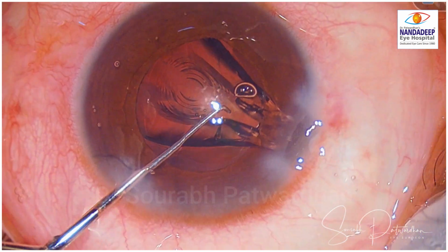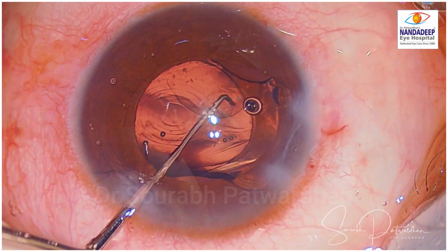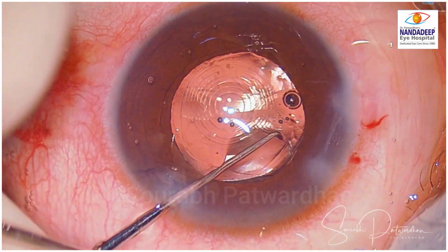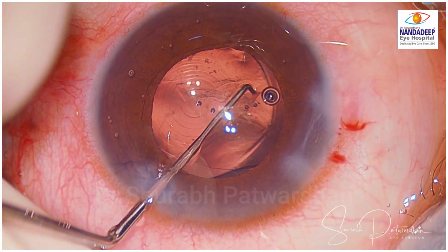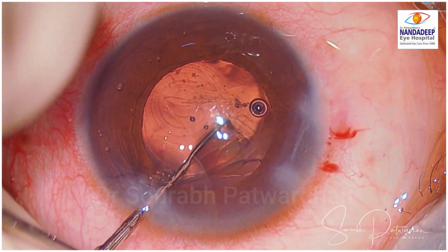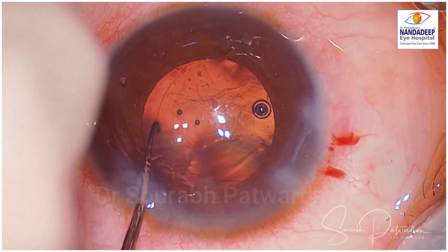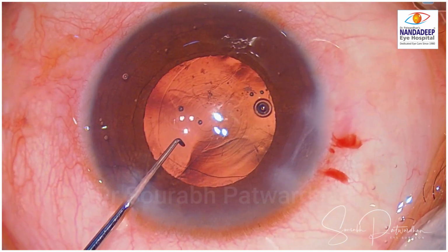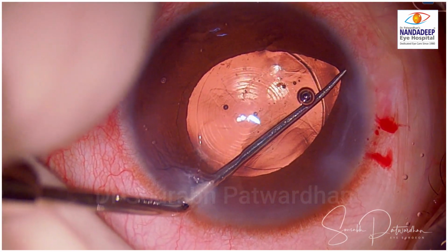So here is a case I am showing where I am implanting a plate haptic trifocal IOL in the bag. That is the plan. The pupil has constricted a little bit over the course of the surgery, and here I am a little bit doubtful about the position of the trailing haptic. So I am just rechecking whether the trailing haptic has gone into the bag or not.